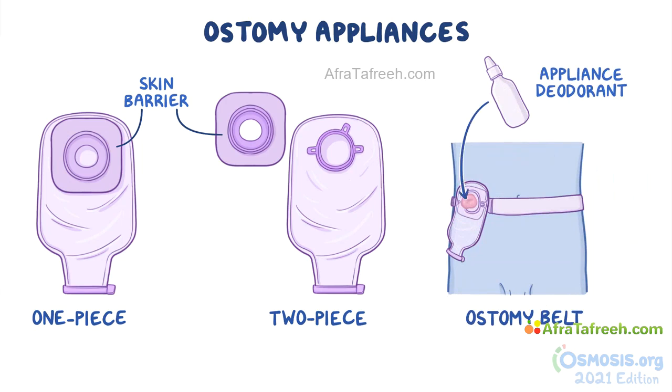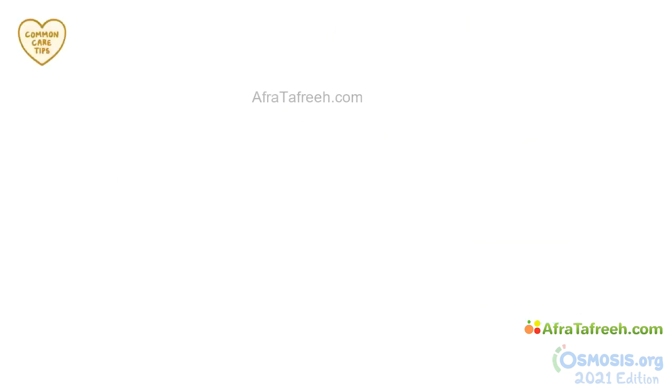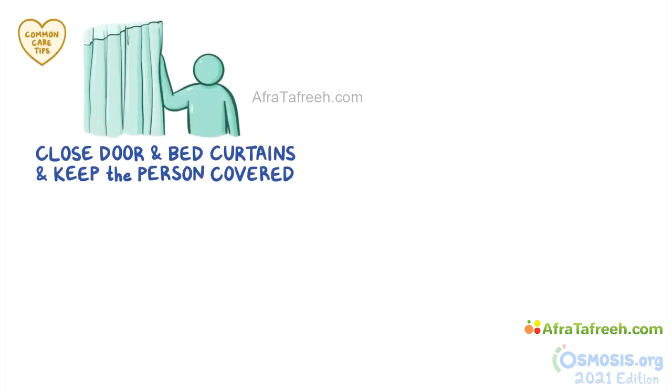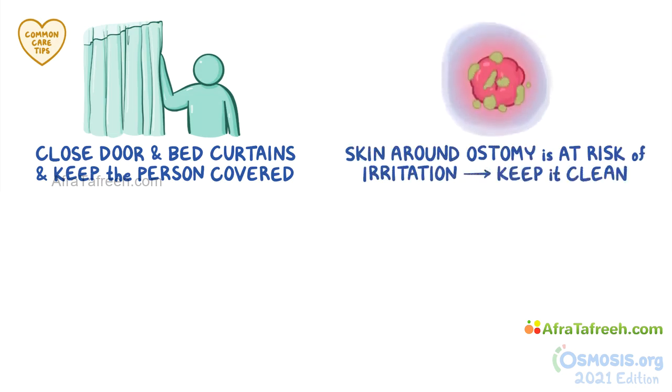Now, ostomies come in different locations and sizes, but no matter the type, there are some common care tips. Close the door and bed curtains and keep the person covered as much as possible for privacy while providing ostomy care. Remember that the skin around the ostomy is in direct contact with feces, putting it at risk of irritation. So, care should be taken to keep it clean.